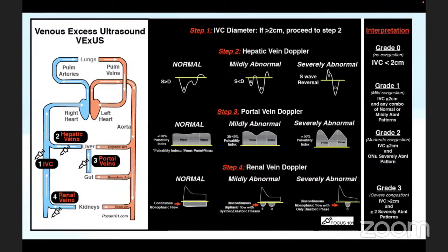the entire topic of resuscitating or reviving the patient will shift. That is, my management will not be decided based on VEXUS. That is what I mean to say, because the reason we are performing VEXUS is to see whether there is fluid overload or not.